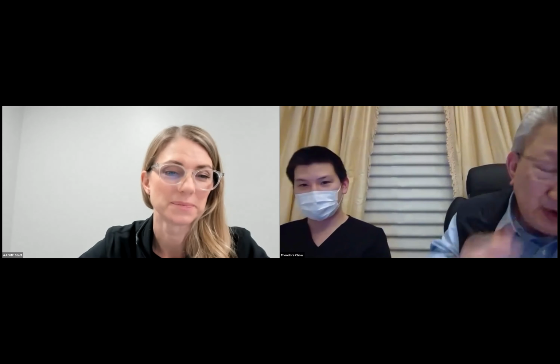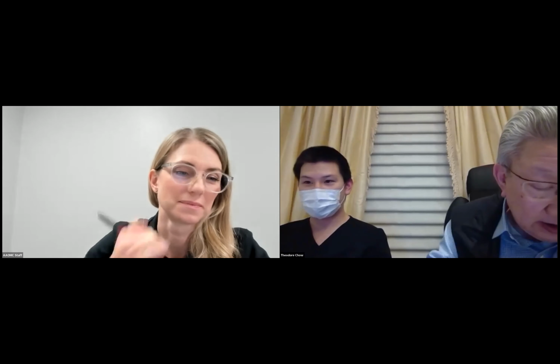Yeah, and really, open eye environment and closed eye environment are two different things, right? Like looking at topography too. If you use the slit lamp to determine how the fit is, it's always wrong, because they keep blinking and the lens is always loose. So you always wait until the tear is gone away, and then you lift away all the lid action, and then move the lens around and see if it's tight or not tight.